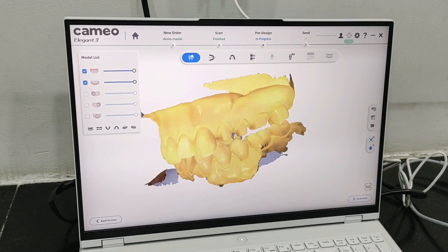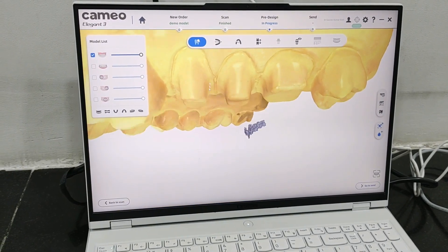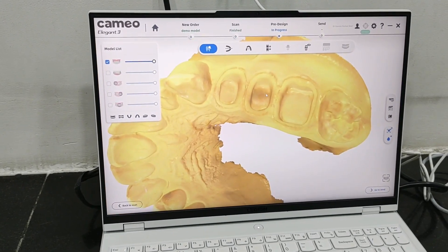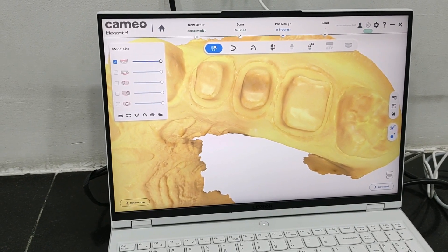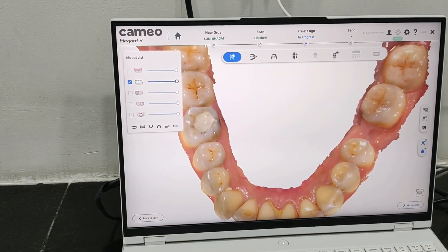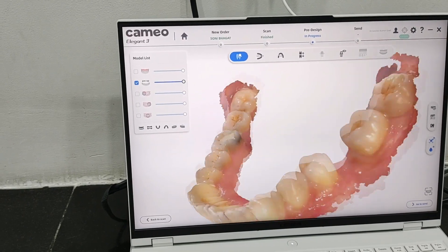We can send this data to the lab, or we can use a CAD software to design our restorations. You can see such beautiful margins are captured. This is a single color model that we have scanned. If you scan a colored model or do a mouth intraoral scan, you get very good color margins. I will show you data of another case — we have conducted the scan for an implant patient. See how beautiful the record is. We have placed an implant here and made a surgical guide for this patient with the help of this scan.